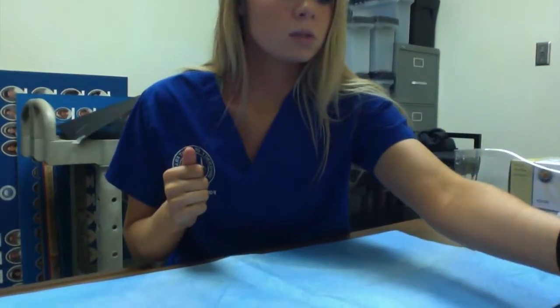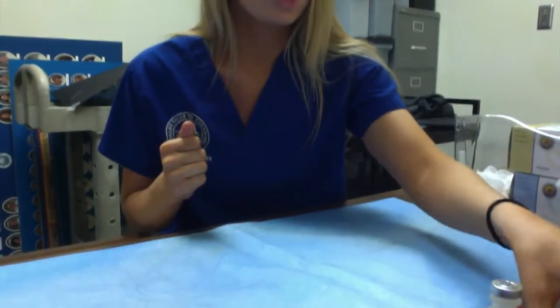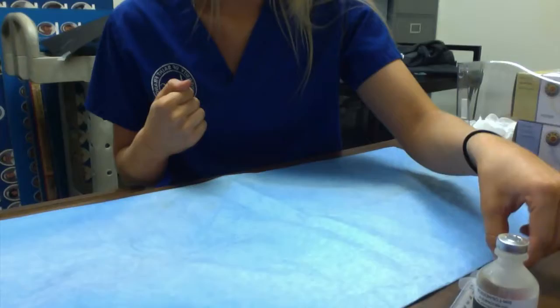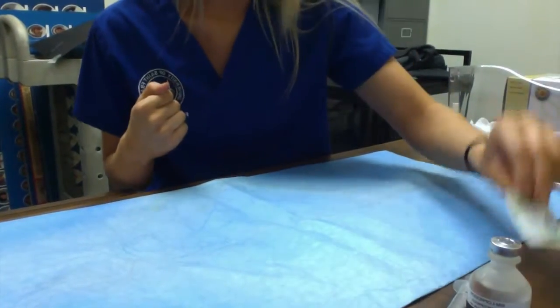Hi, my name is Megan and today we're going to be practicing drawing up some medication. First I'm going to assemble my items: we have the lopressor, a five milliliter syringe, a non-filter needle, and an alcohol prep pad.